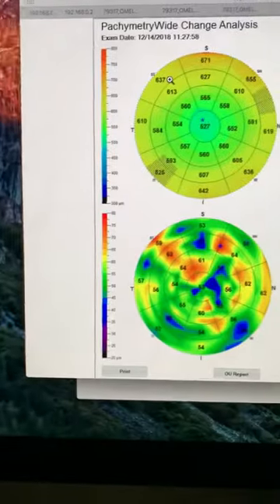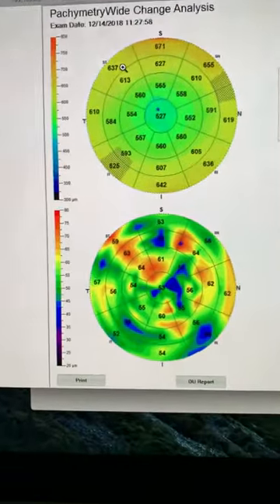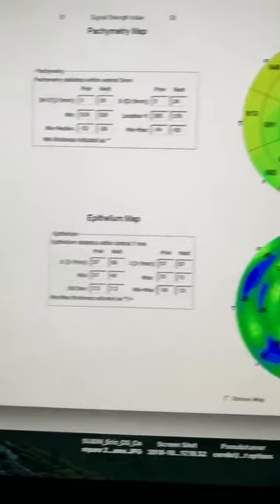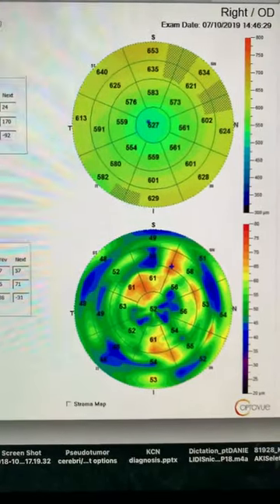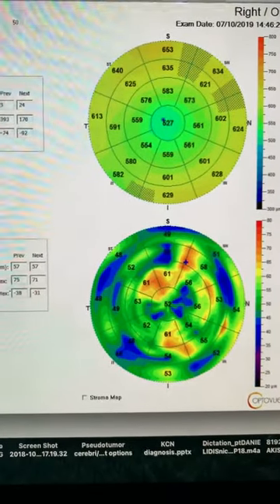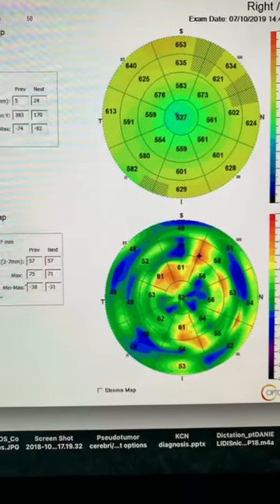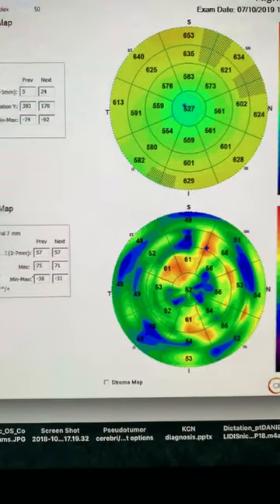These are the epithelial maps, showing changes from September 2018 until today on the right eye. And we'll see the same imaging in the left eye.